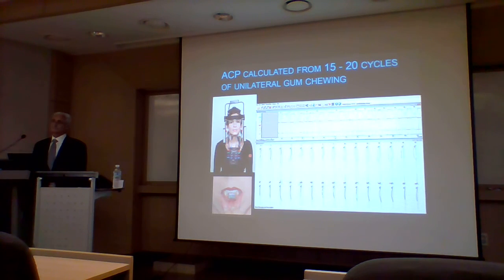머리에 뒤집어쓴 게 그 자석의 움직임을 이제 기록을 하는 거지. And each of these chewing strokes is then calculated in all 3 dimensions to determine what's called an average chewing pattern. 이제 위에도 디텍터가 있고 머리 꼭대기에 있는 거, 그다음에 양쪽에 있는 것도 해가지고 3차원적으로 하악 전체의 움직임이 어떻게 되는지 합쳐가지고 평균적인 추잉 패턴을 계산을 한 거예요.